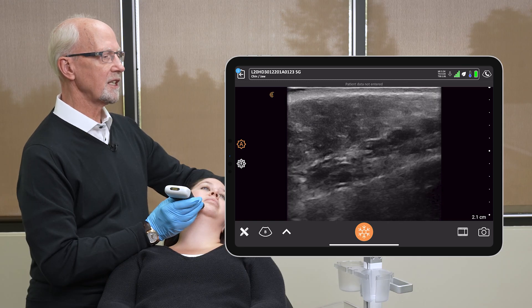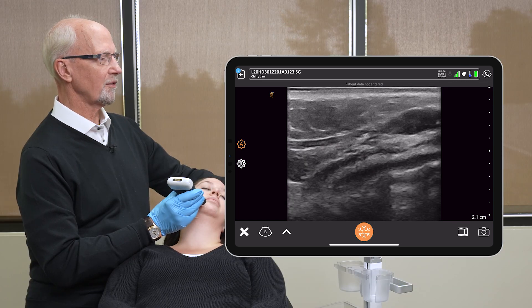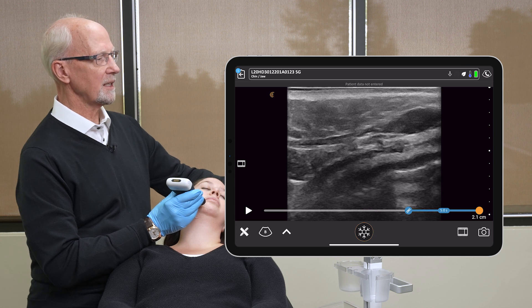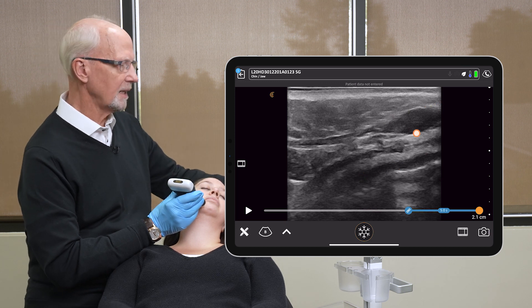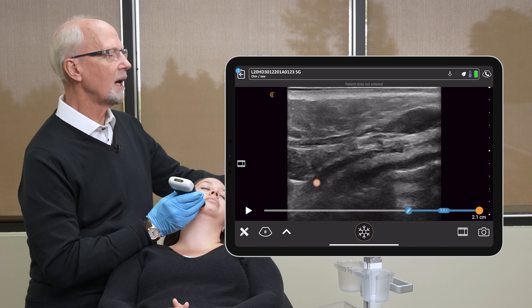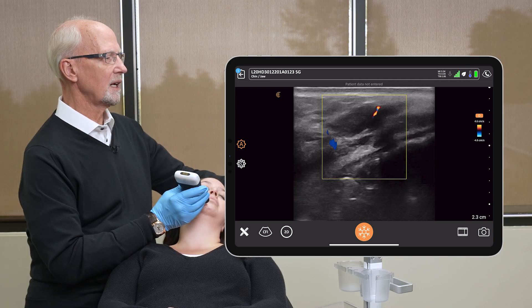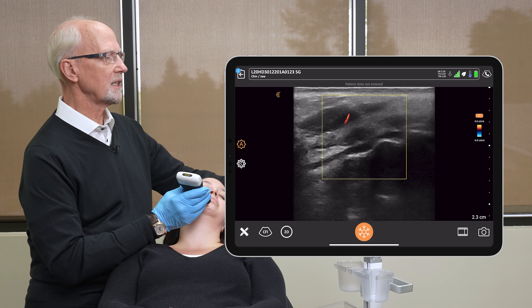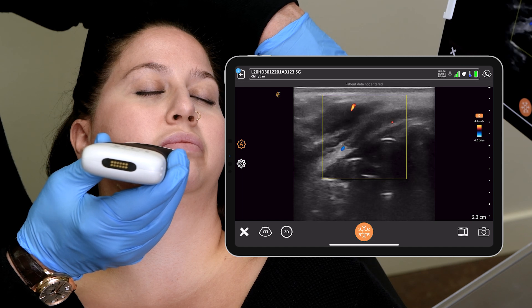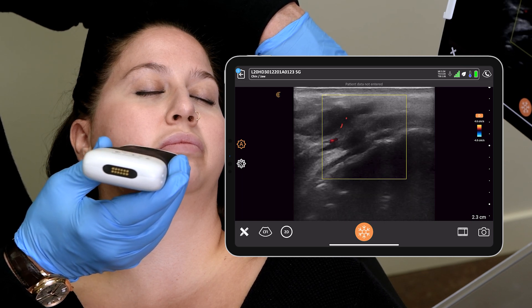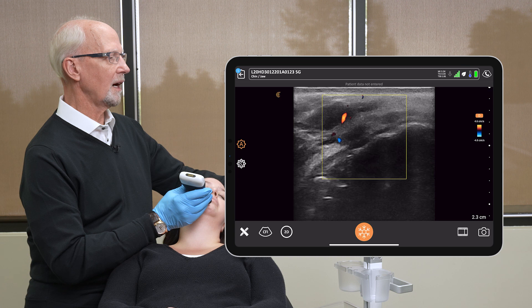Moving on to the distal third of the mandible, we're now starting to come into the mimetic muscles. Freeze — here we really have three together: what I believe is the platysma, the depressor anguli oris, and the depressor labii inferioris. We can continue to see some small vessels as we move across the chin. Here's the labial mental artery as it starts, and it's now coursing up as the inferior labial artery towards the lip. A good place to look for this is right between the DAO and DLI, as we can see right here.